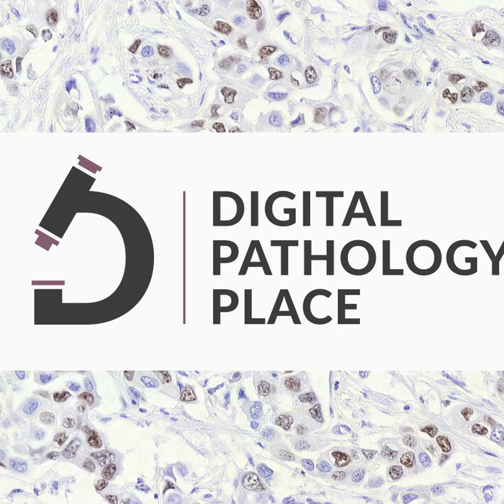And if you're trying to apply a model that was trained in a source domain, let's say from one scanner, to a target domain, let's say a different scanner, something about those images may be different that the model doesn't know how to handle. So maybe your training set of images were from the Aperio scanner, and you have another data set of images from Hamamatsu, and you want to apply your model there.